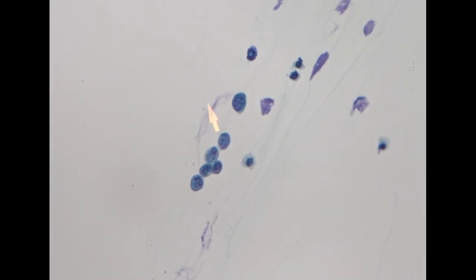So again, we see so-called small round cells with very, very high NC ratio and hyperchromasia. So these are compatible with rhabdomyosarcoma. So these are involvement of rhabdomyosarcoma directly into the leptomeningeal space, and the tumor cells are present in the CSF specimen.